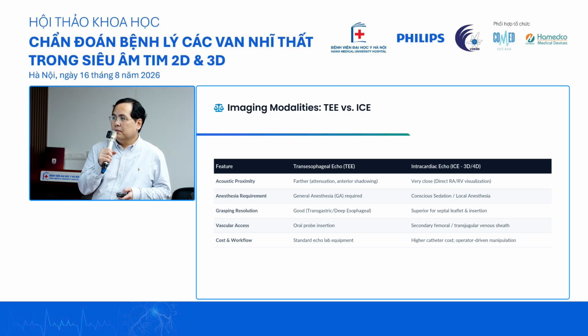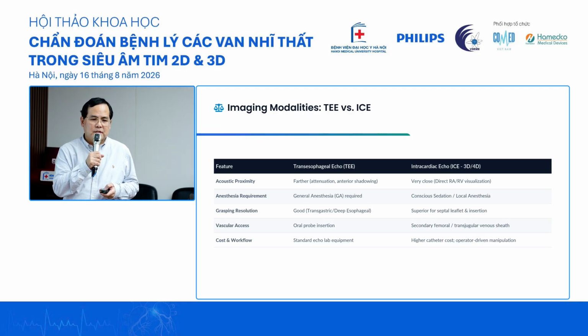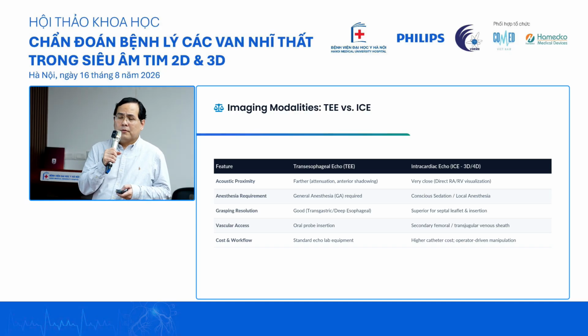Okay. So for intracardiac echo, our center is highly selective for patients who are able to pay and also suitable patients. We have also even done cases with a transesophageal echo together with intracardiac echo.